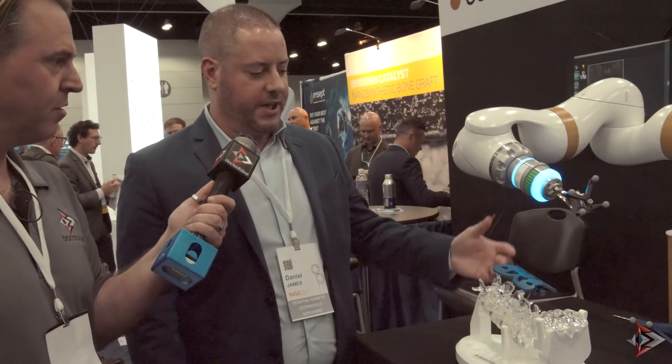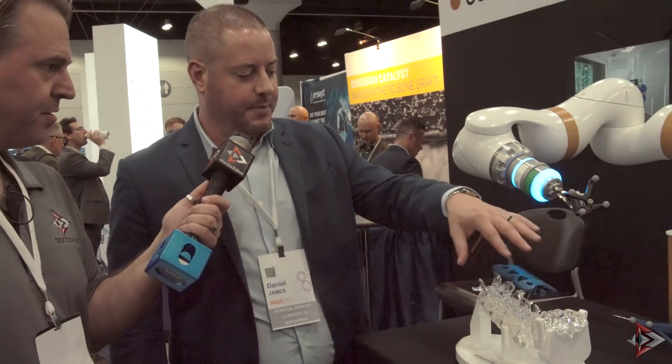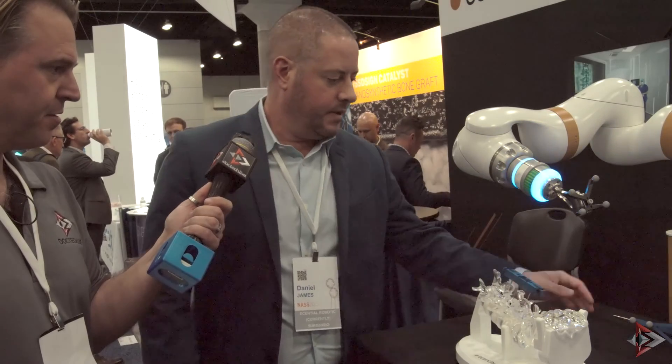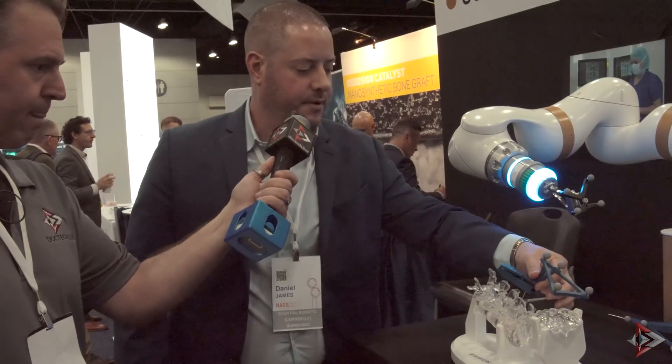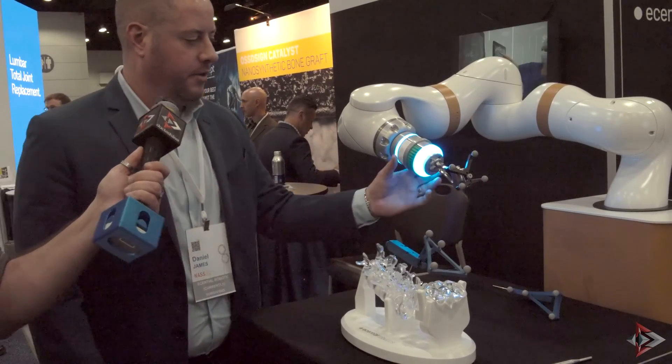The registration process is easy. We do a 2D, 3D spin. After the spin is done, this phantom comes off. Patient tracker goes on and you're all set. You're ready to go.